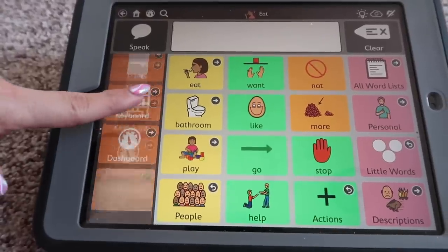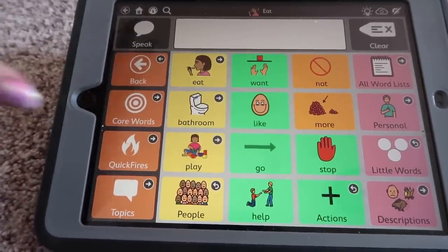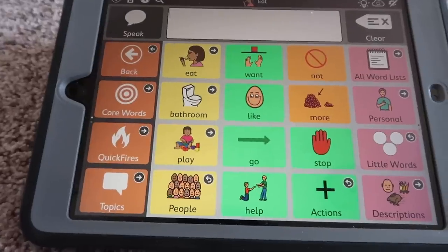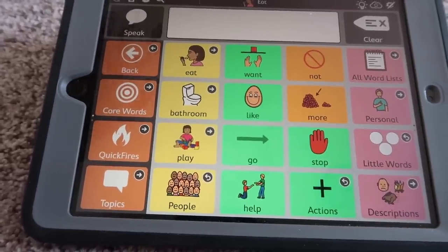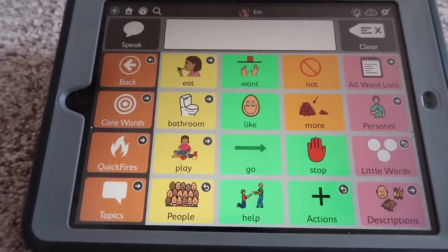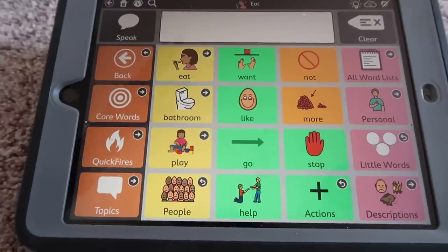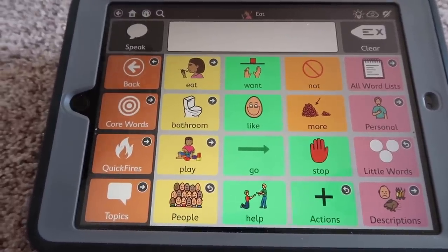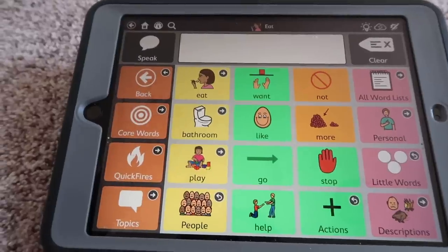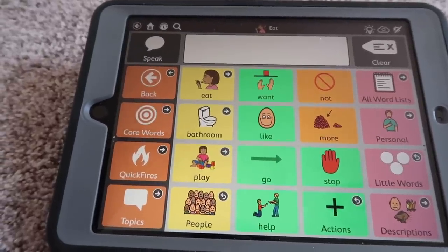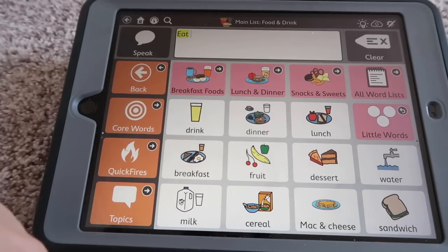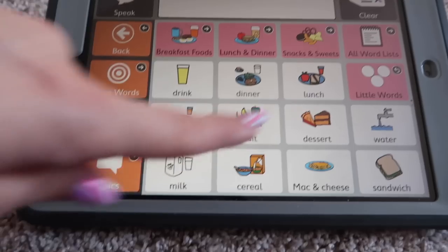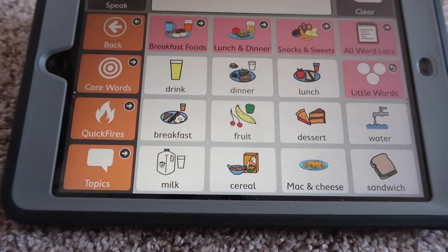So here is the home page — we call this the core words. That's where her main things are that she needs. She is going to have way more words on this than Griffin, because Griffin's receptive language isn't as good, so he needs a super simplified version. She understands everything, so there's a lot more things in here that she can use. We have eat, and then we have like breakfast, lunch, snacks, drinks. We have mac and cheese, which is her favorite food right now.